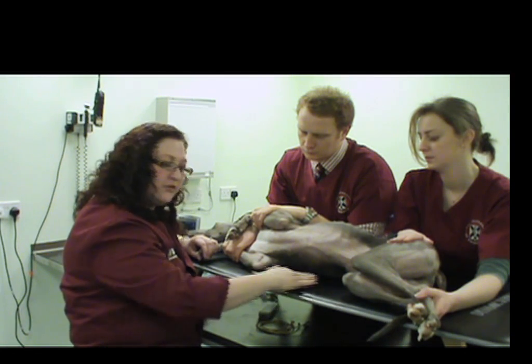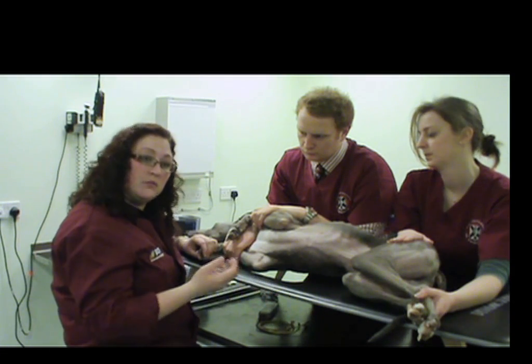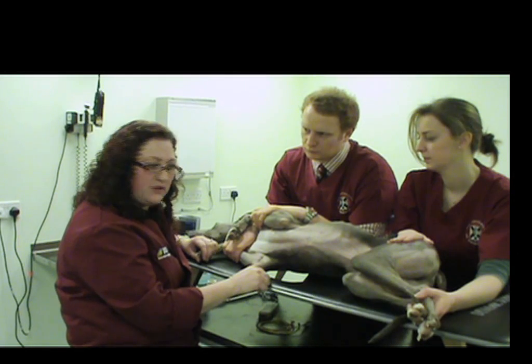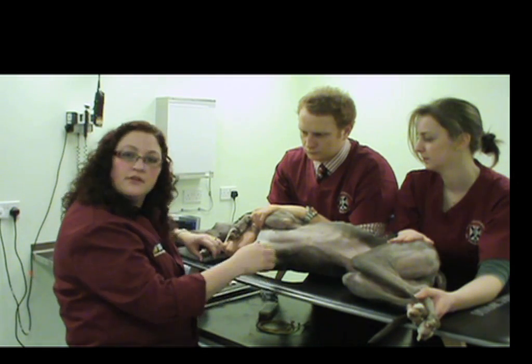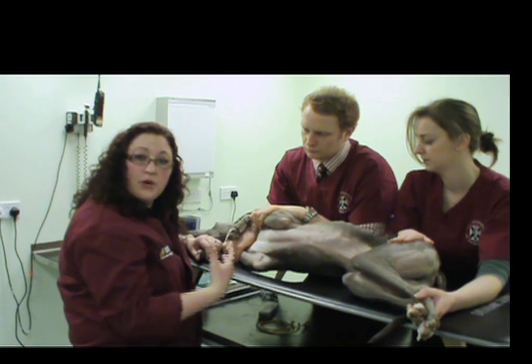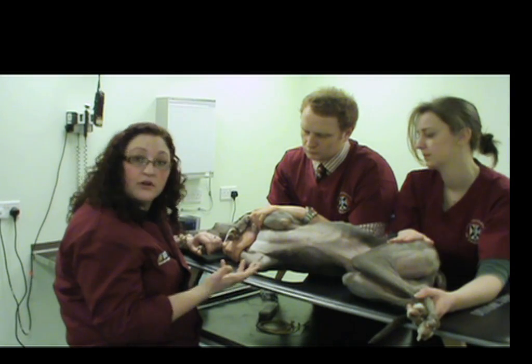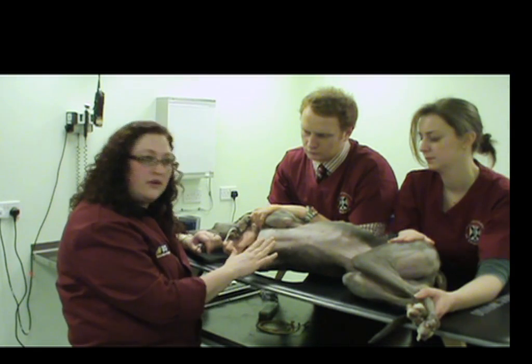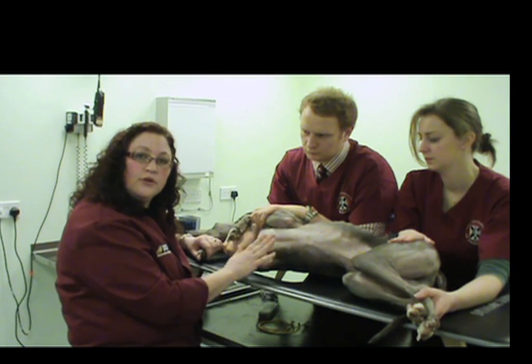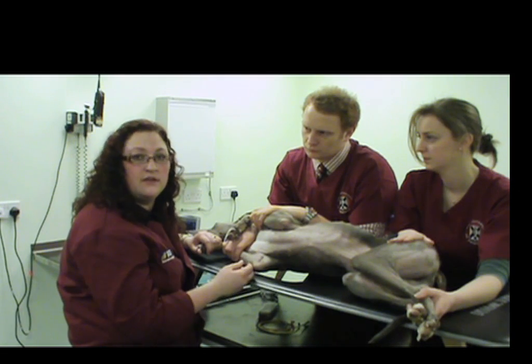This table is padded, so we haven't placed a vet bed or towel on it, but if you were using a homemade table, just ensure that you put something on there so that the patient is comfortable. The other thing to consider is the use of sedation. Most pharmaceutical agents that we have at our disposal are going to affect cardiac function in some way, and so if we're wanting to get a true evaluation of the heart, it's best if we can perform this in an unsedated animal.